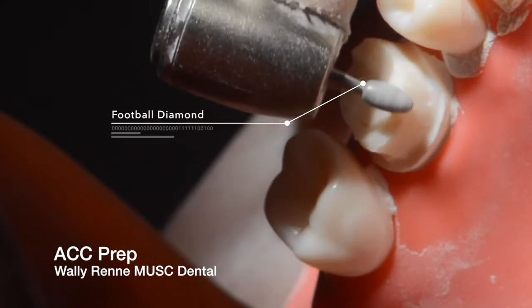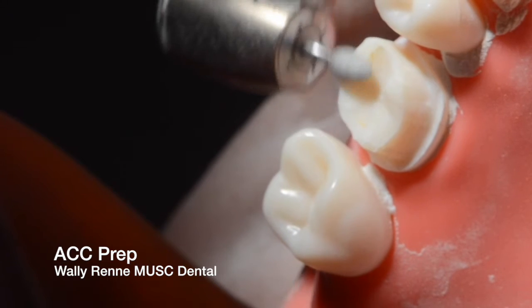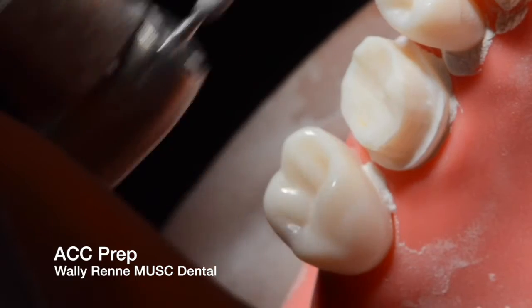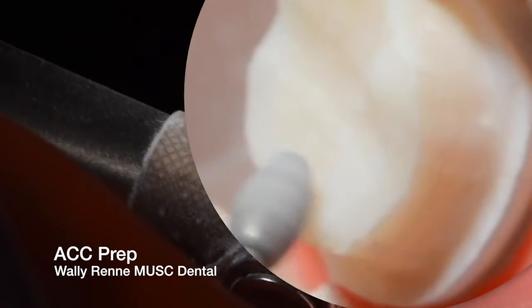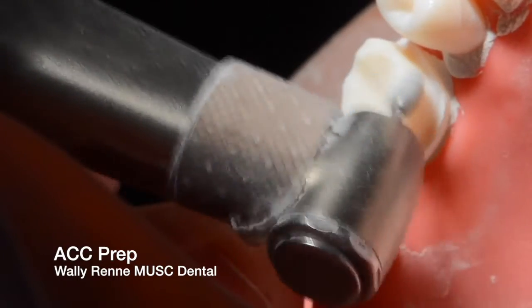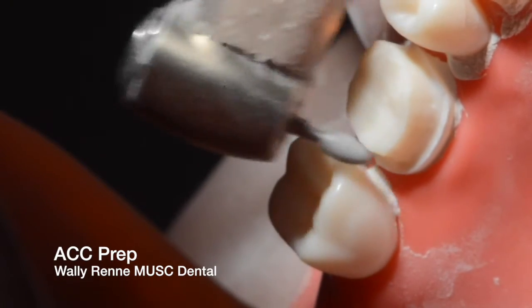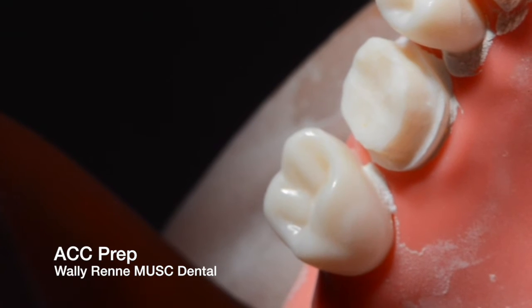Here I've transitioned to a football diamond and I'm putting the functional cusp bevel. This is a maxillary tooth — though it looks mandibular because it's upside down; a lot of this was filmed in a mirror. I like to use the football diamond to smooth out that basic anatomy. You really don't want any chicken scratch or weird extraneous anatomy — just think smooth and round for all ceramic. That functional cusp bevel is at a 45-degree angle and is about 2 millimeters wide. You also need to round the non-functional cusps and the mesial and distal marginal ridges.